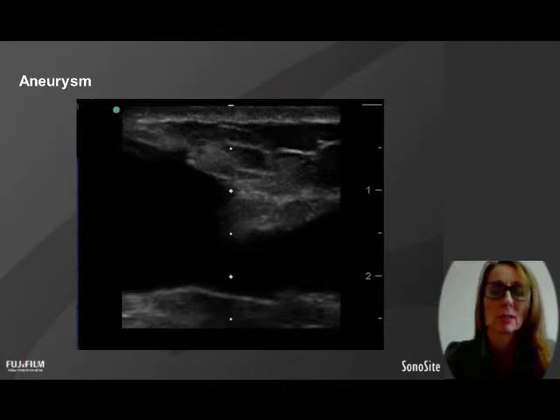So we put the ultrasound on and we could see that the segment further up where they were trying to puncture was actually 1.5 centimetres deep, and so it was just too deep for them to needle. So it helped them to get a map and make a plan on the best areas where they could move around to try and minimise the area puncturing that this patient was receiving.